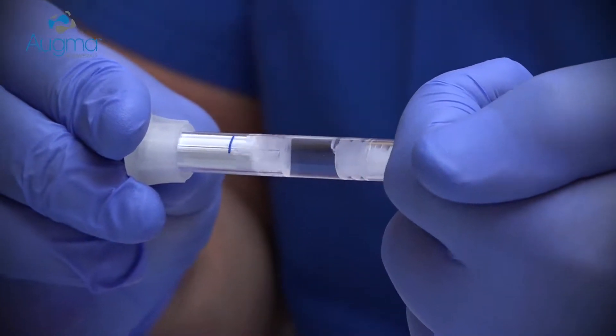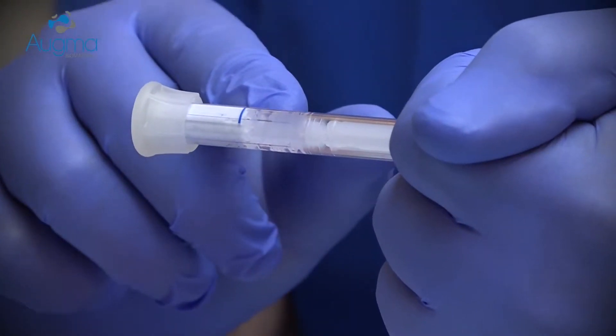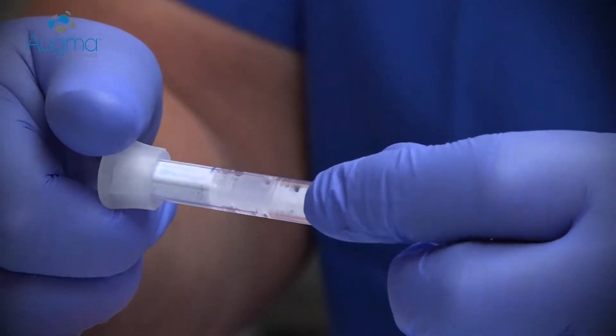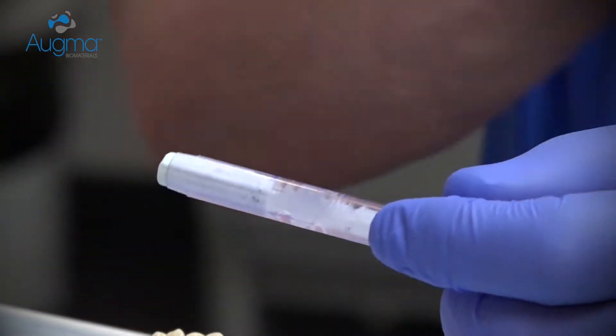Press the shaft against the palm of your hand until the first piston reaches the blue line. Now the material is already activated. Remove the syringe head.